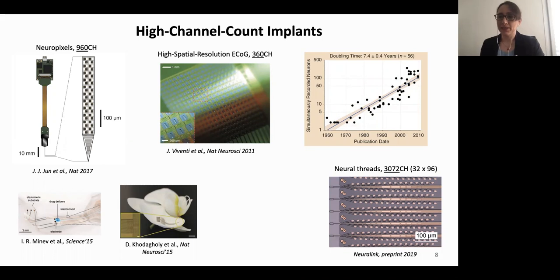But when we look at the options that are available in terms of therapy for patients today, there are very few devices, and they're not quite compatible with such advanced technologies. So we believe that this gap can be partially filled by designing better electronics that can reliably record and process, and possibly even stimulate, on many channels on a tiny and low power device with minimal surgical overhead. And many of us, and again, some neurotech companies, are currently working toward this goal.